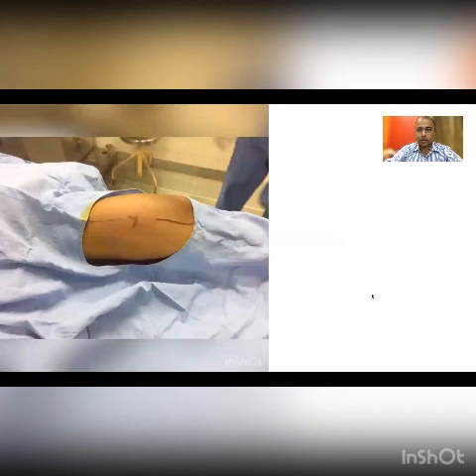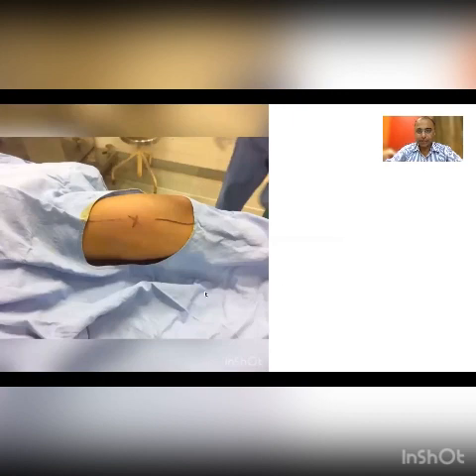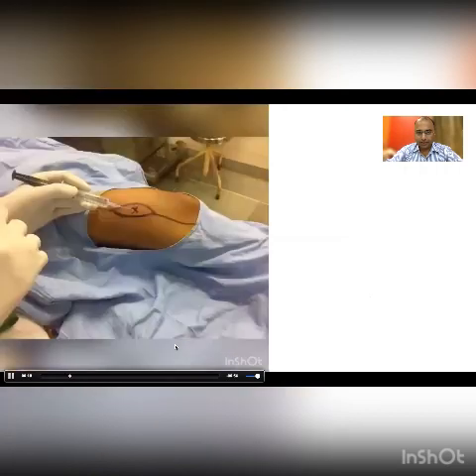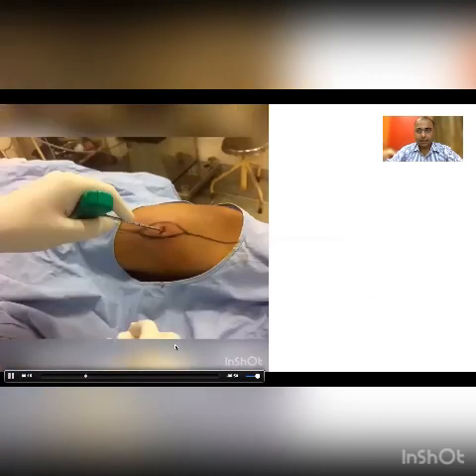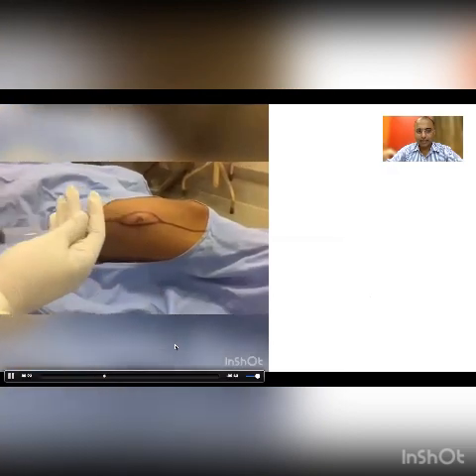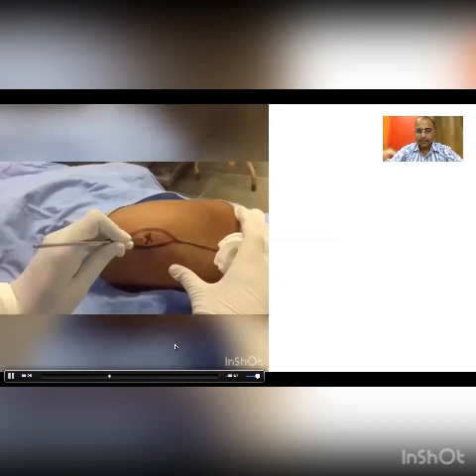We will now see a video of a patient for whom bone biopsy was performed. The first step is marking the skin incision — in this case, a medial skin incision was marked. This is the final biopsy scar, which should be planned by the treating surgeon. The first step is giving local anesthesia, followed by insertion of the Jamshidi needle to take a few good cores.